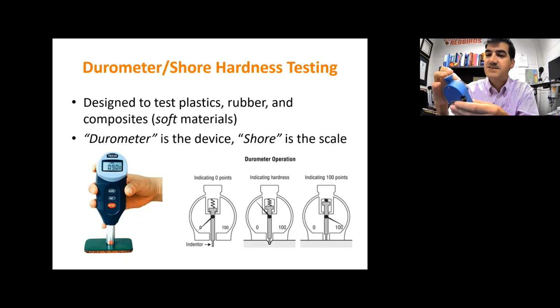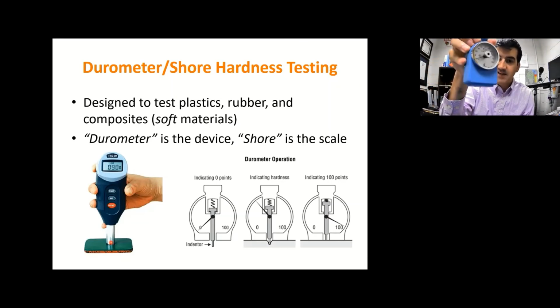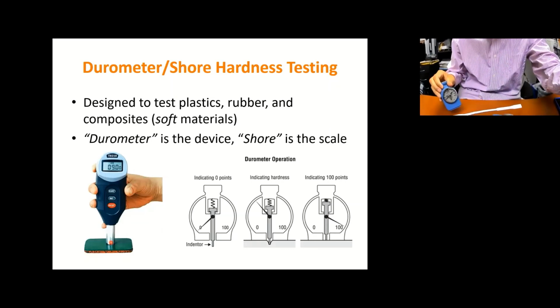And it's kind of nice because these have a, let me actually do one, because I don't think you can see it, but they actually have a little red needle that's going to move with the black needle, and then the red needle is going to stay, so it's easier to read. So here, I'm going to go ahead and do it.